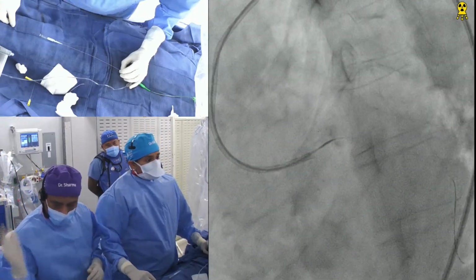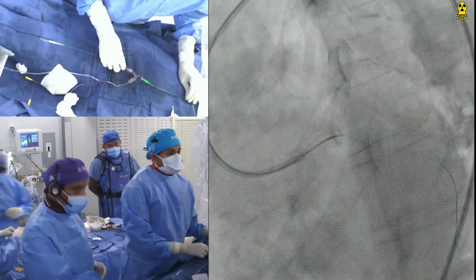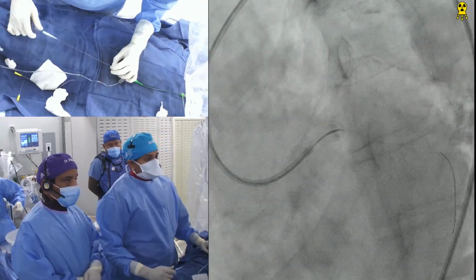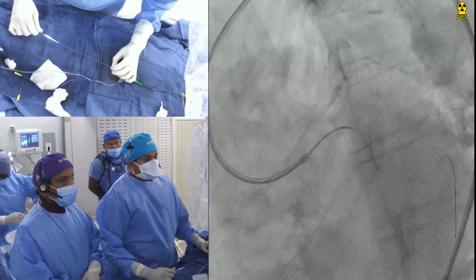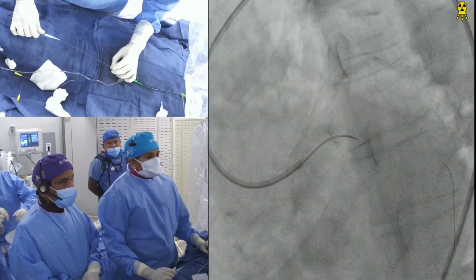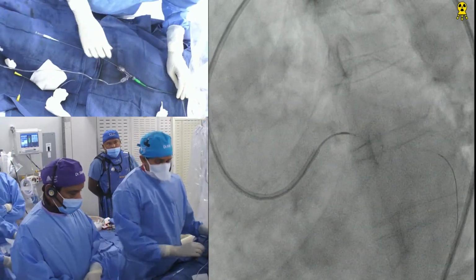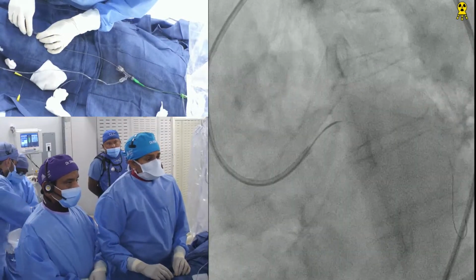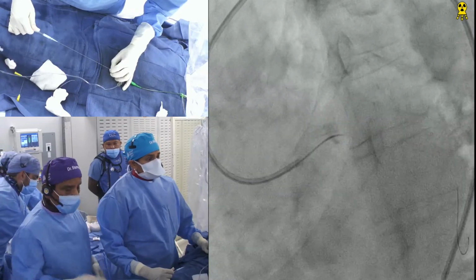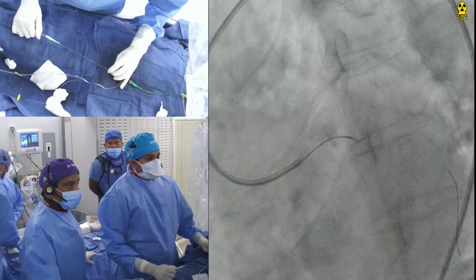Good. Remove that back. Good. This is a regular Corsair, right? Yeah. No guide support, that's the issue. You did? Good. No, it went in now. 1 more millimeter, then you're good. No, not there yet. Yeah. Okay, there we go.